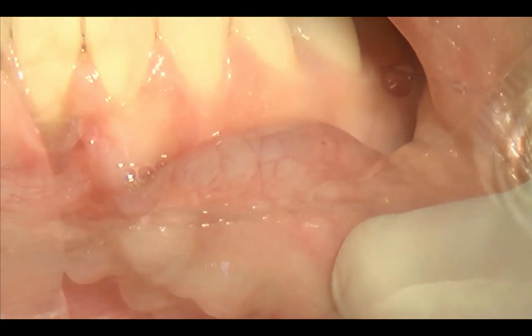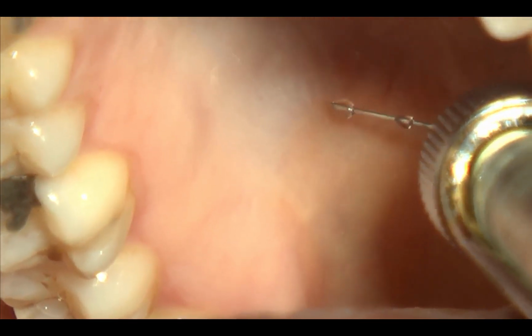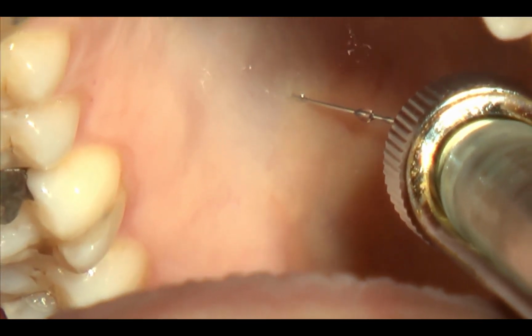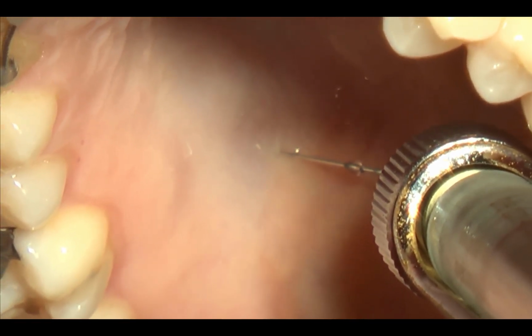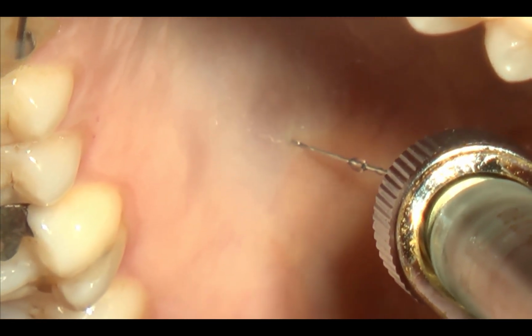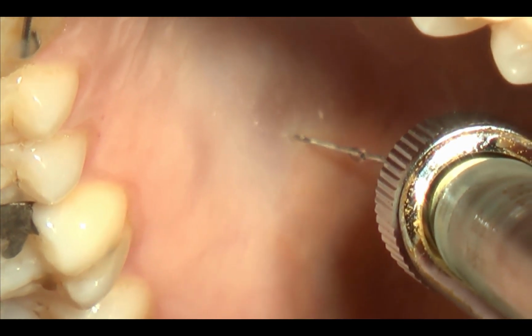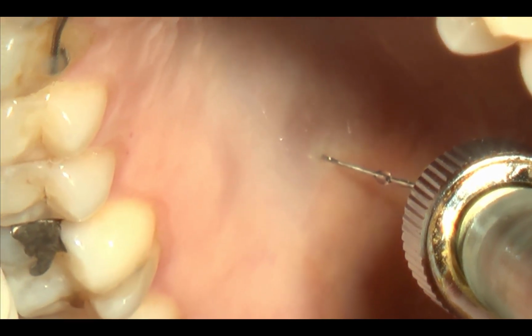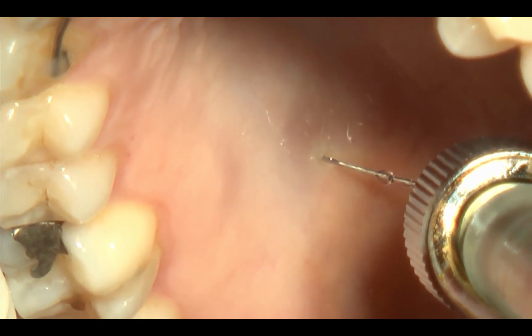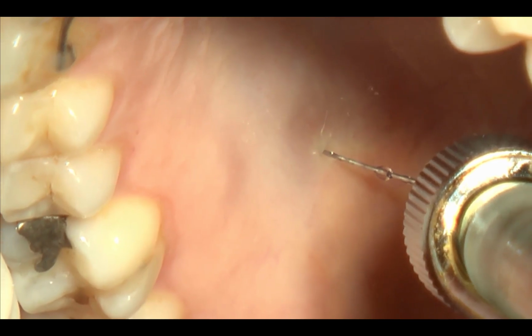And also when you make anesthesia in the palate, you never have to make anesthesia at the level of the hard palate, but only, you see, at the level of the soft palate, because here the spread of the liquid is completely less painful and you don't make any perforation or vascular shock in the area that is going to be grafted.